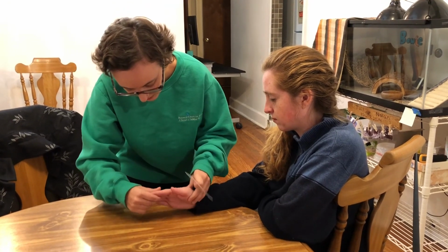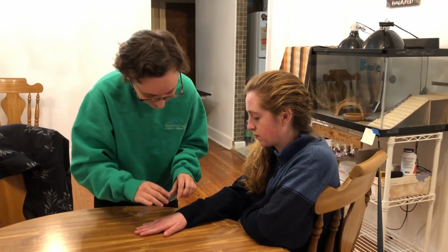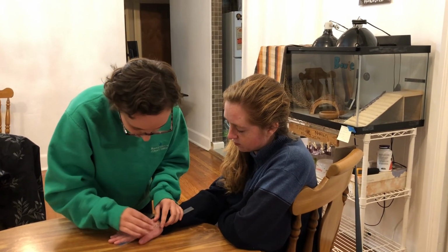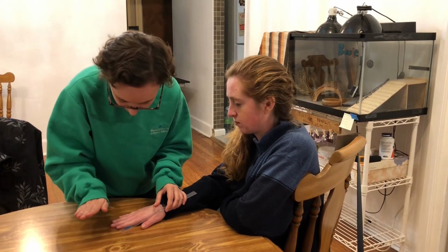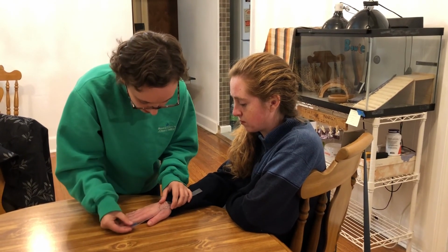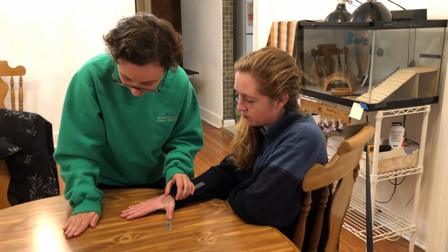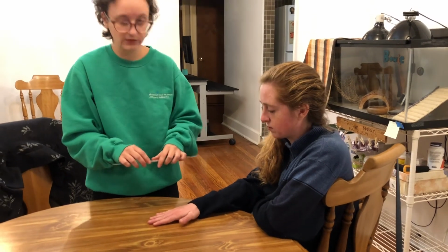And now I'm gonna place your hand down flat on the table like this because we're going to do radial abduction. I'm going to put my fulcrum over my patient's anatomical snuffbox. My stationary arm is in line with the wrist, and my movement arm is going to follow her thumb. So what I want you to do is slide your thumb across the table out toward your wrist as far as you can. Okay, and again for radial abduction of the thumb, I'm getting 50 degrees, which is normal as well.